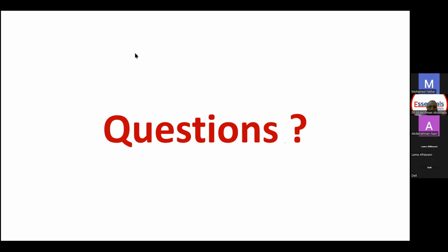The last question by Dr. Ahmed Fayed was asking if we have a misnomer of adaptive modes as they are dual control. Is the real dual control mode defined? How can we define dual control mode? Dual control modes shift from pressure control to volume control in the same breath. That's the operating system of a dual control mode.